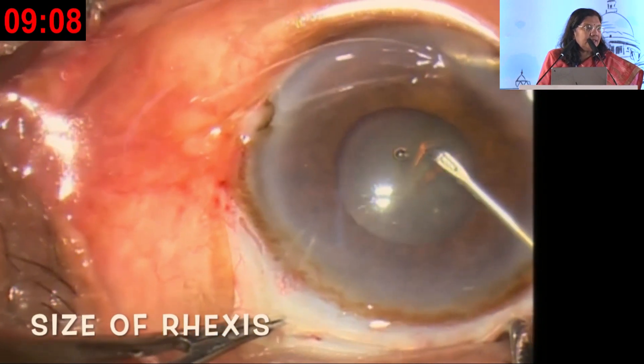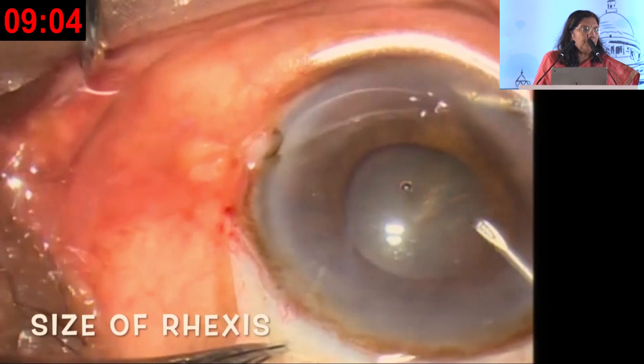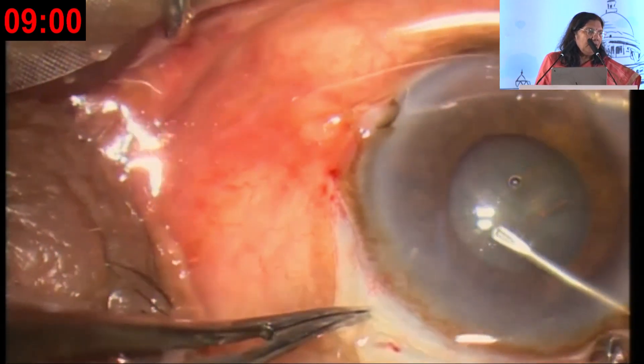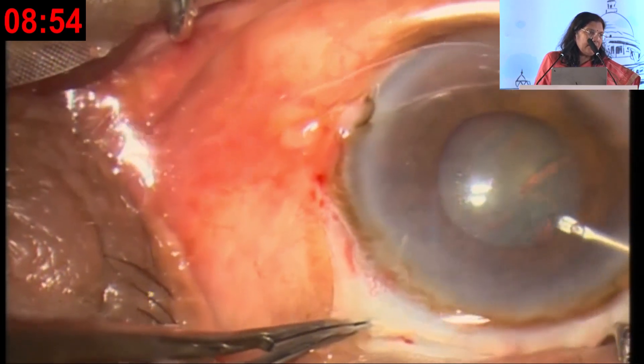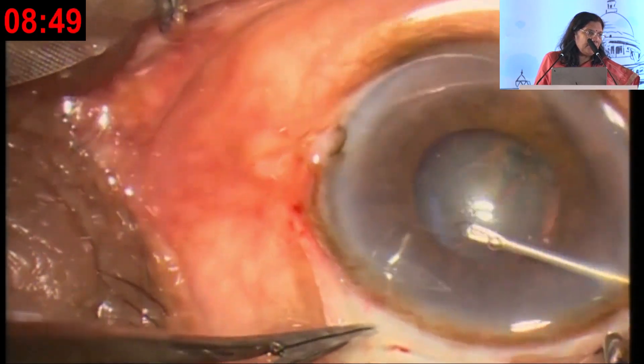The rhexis is done in the visible area of the pupil, because if you try to go underneath it you may not see and your flap may disappear. Making the rhexis in the visible area — staining with dye would have made this even easier, but a good microscope can help you complete the rhexis even in this situation.